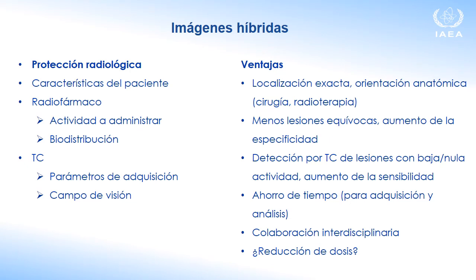Moreover, if you look at hybrid imaging, we have to consider the radiation protection, the patient characteristics, the radiopharmaceutical with the activity and the biodistribution, but also the CT with the acquisition parameters and the field of view. The advantage is that you have an exact localization and anatomical orientation, very important for surgery and radiotherapy.